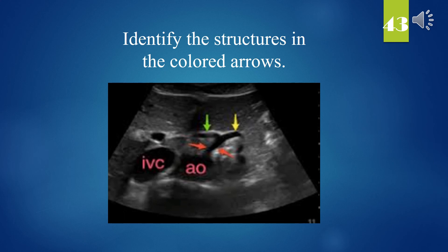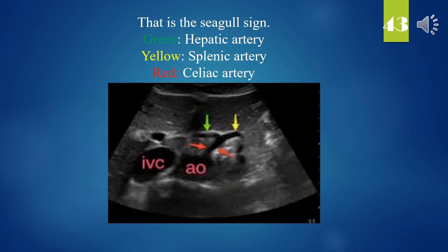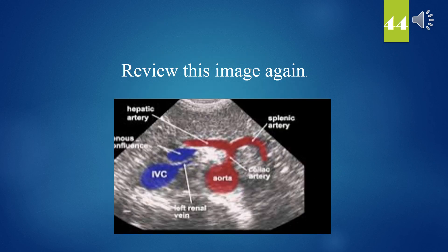Identify the structures in the colored arrows. That is the seagull sign. Green: hepatic artery. Yellow: splenic artery. Red: celiac artery. Pause the video and review this image again.